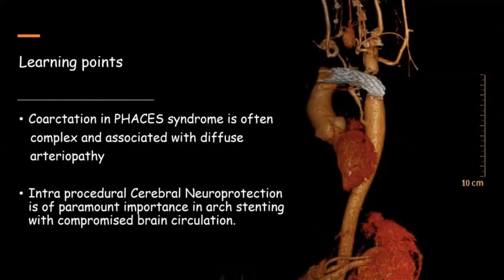The learning points from this case are that the coarctation in PHACES syndrome is often complex and associated with diffuse arteriopathy, and intraprocedural cerebral neuroprotection is of paramount importance in stenting with compromised brain circulation.